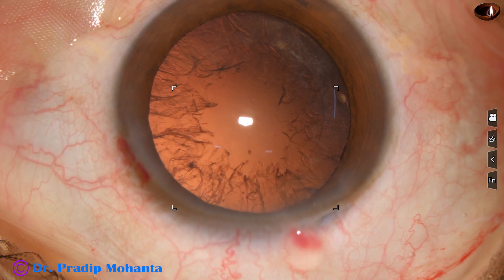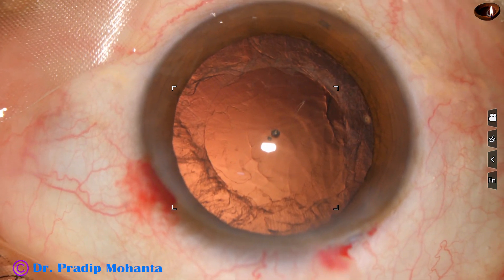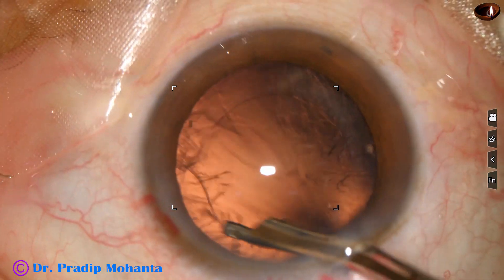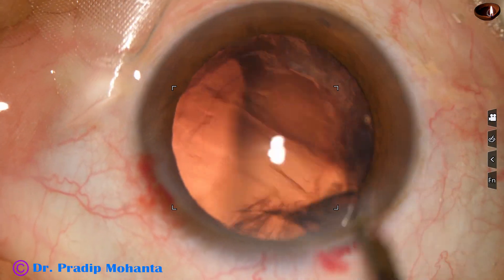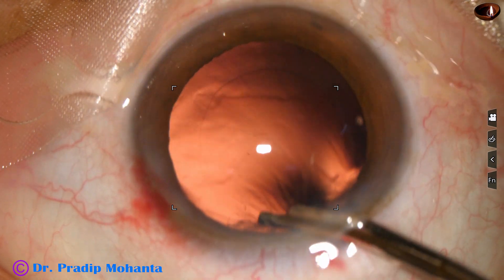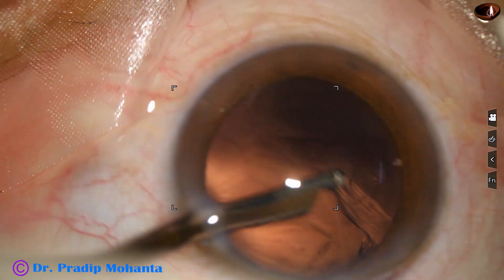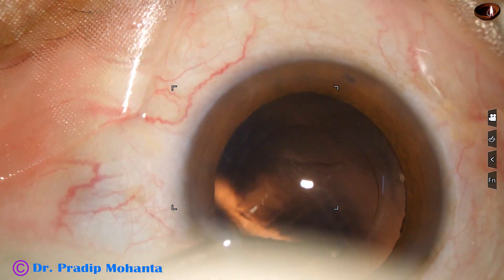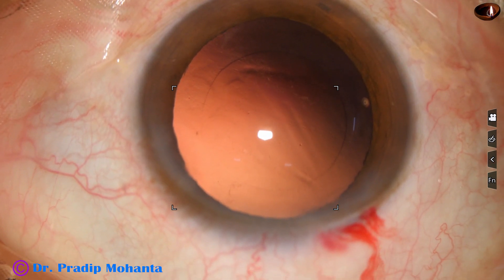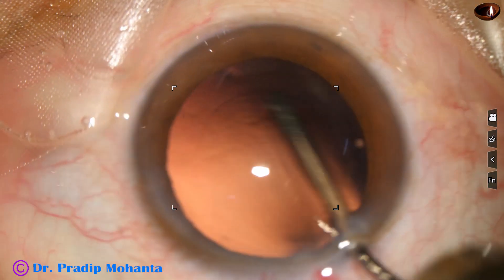Now there is some cortex — a lot of cortex — along with some viscoelastic. This is a 23-gauge Simcoe cannula, and in a very short time you can remove the cortex with this instrument. I use a separate bottle and a separate drip set for this Simcoe cannula. Cortical cleanup is done, and hydro-implantation of a single-piece monofocal intraocular lens is performed.